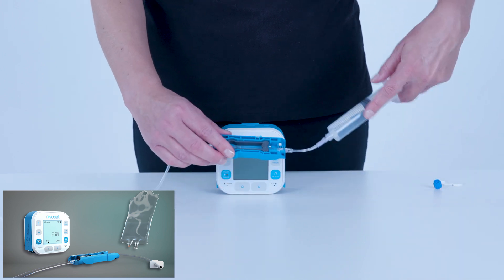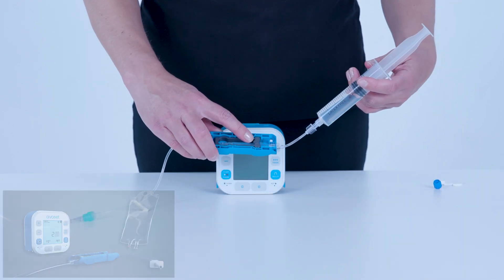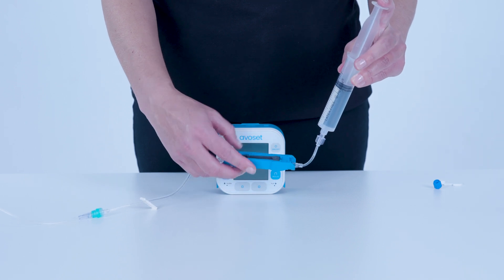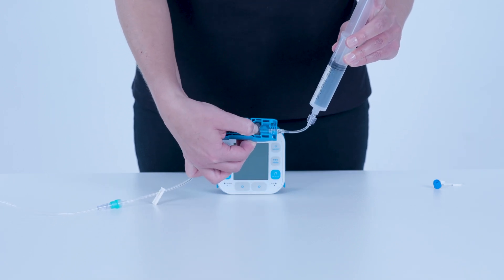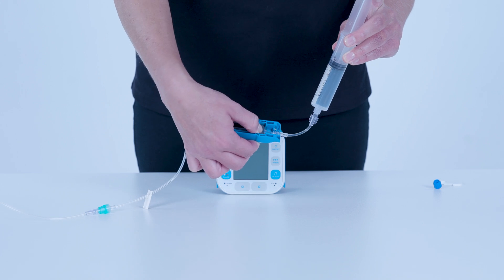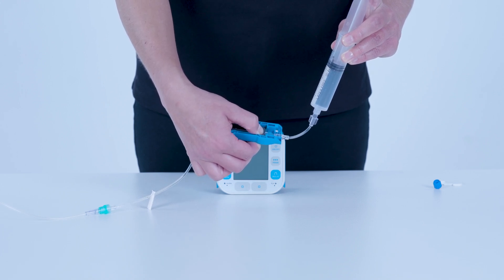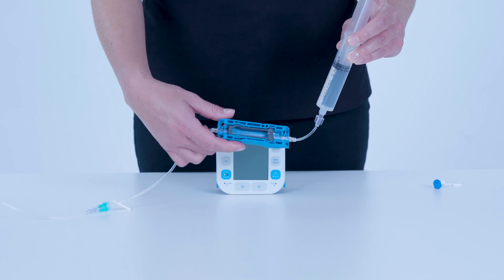When using an infusion bag, press and hold the valve to allow the infusion fluid to fill the line. Release the valve when all air is displaced and fluid has reached the end of the set. Close all clamps on the line.